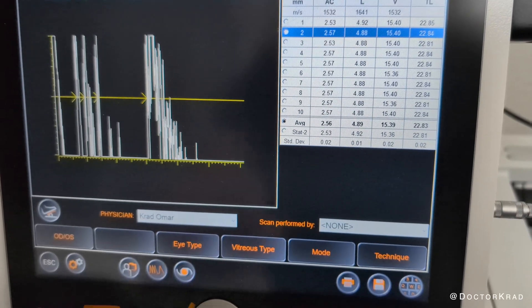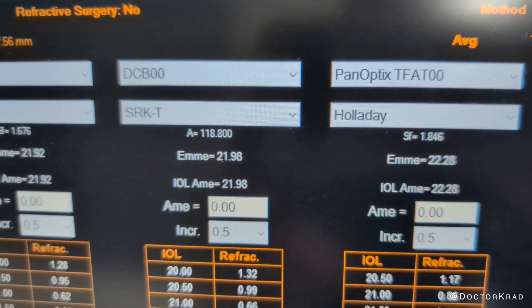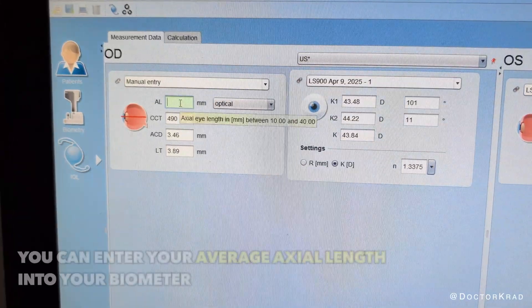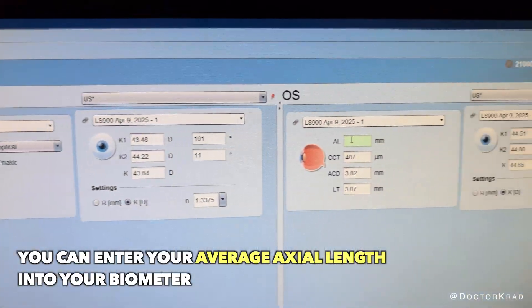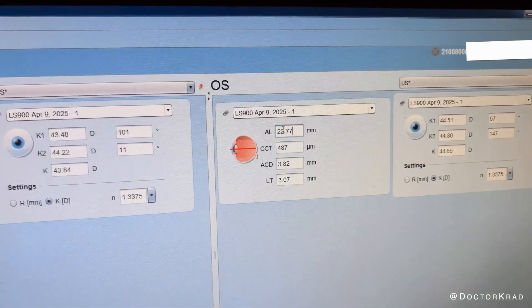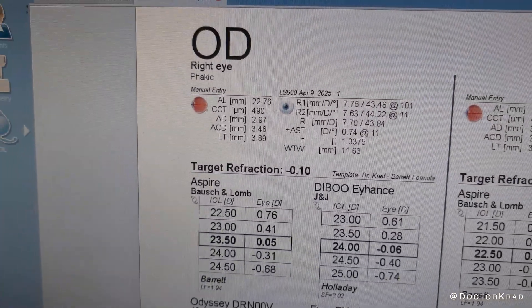While the device will provide lens powers to choose from based on built-in formulas like the Holladay, it doesn't have all the formulas of your more robust optical biometer. So although I appreciate the lens power recommendations from the device, I personally don't use them. I take the average axial length measurement and plug it into my optical biometer. I then use the Barrett formula for most of my cases. This has worked great for my patients.